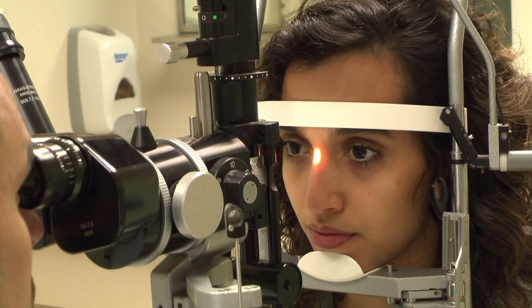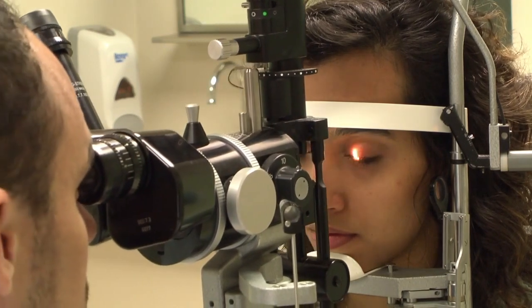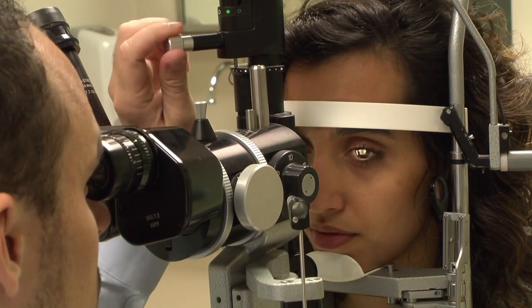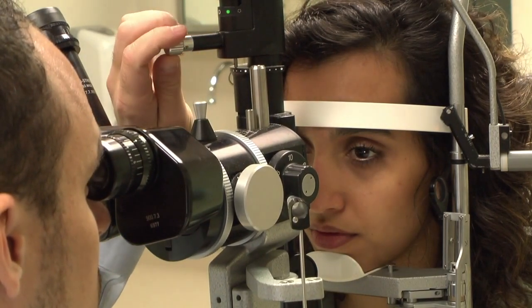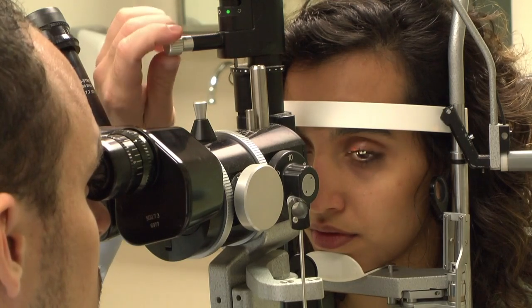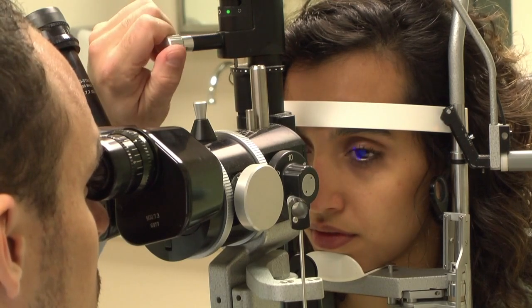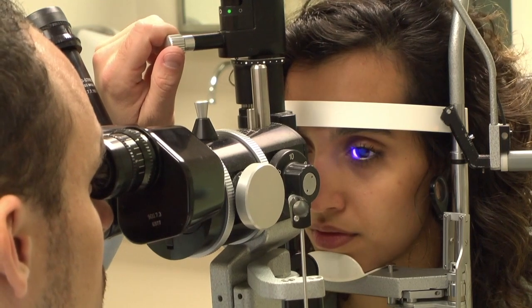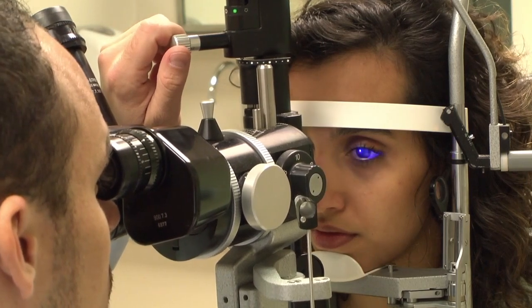Turn the dial on the illuminating arm to adjust the width of the light beam. Adjust the vertical height of the beam by using the dial at the very top. Turn on cobalt blue light by twisting the same dial as far counterclockwise as you can until it clicks. It is a good idea to check all these functions before bringing a patient into the room for the first time. Be methodical with your slit lamp exam.